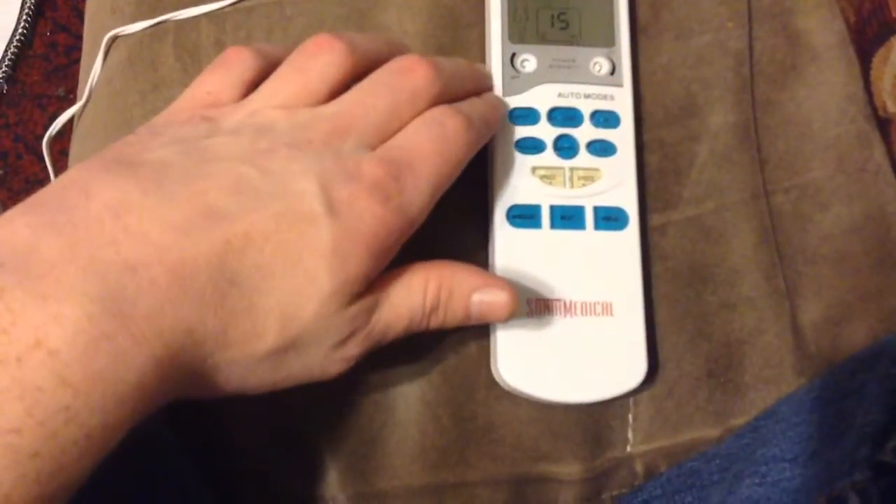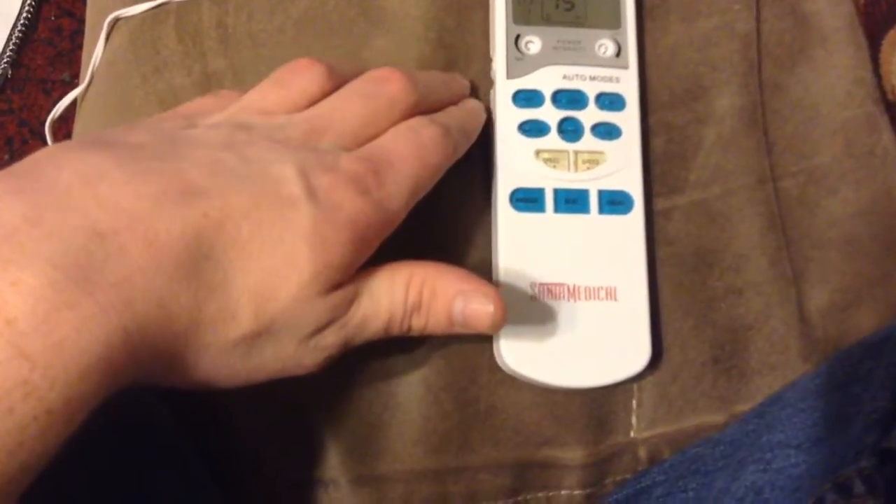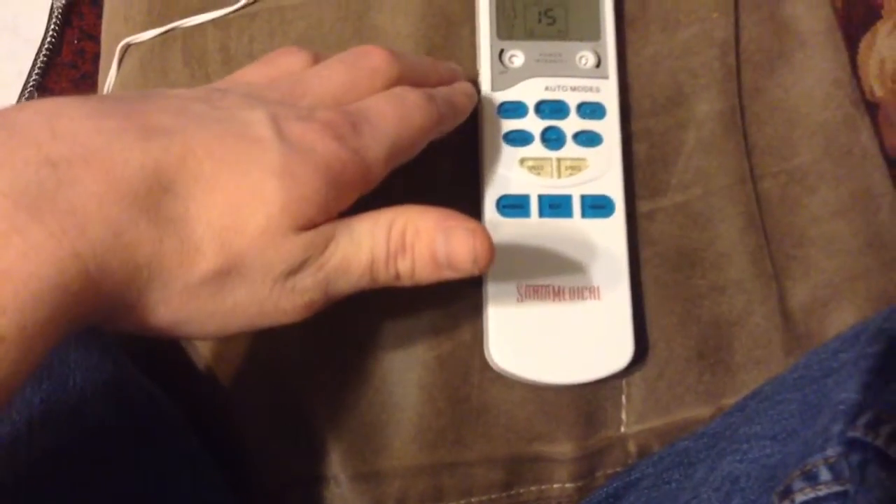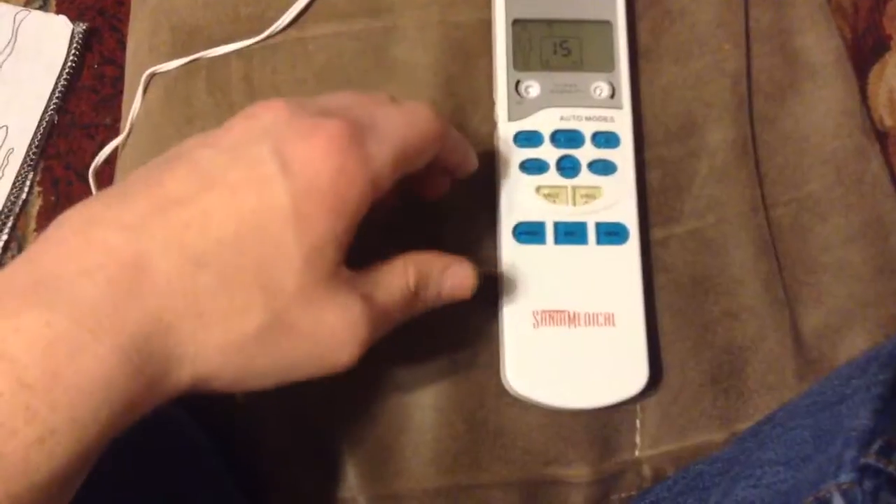Right now it's pulsating. You can kind of see my thumb moving. Yeah, that's not something that you could do on your own. I'm going to stop it there. Yeah, tingles quite a bit.